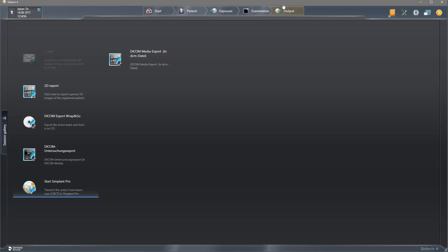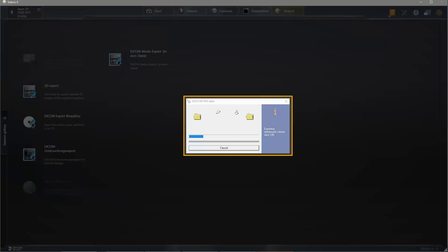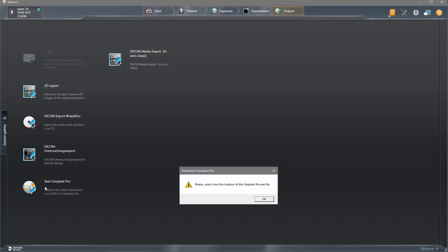We tap on the option Start Simplant Pro and the status of the transformation is shown in a small window. The first time you are going through this workflow, you will be asked to select the location of the Simplant Pro.exe file.